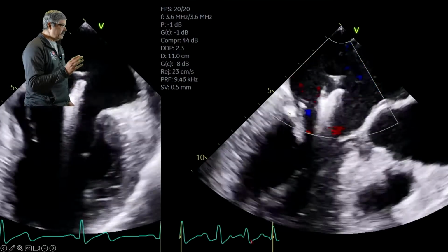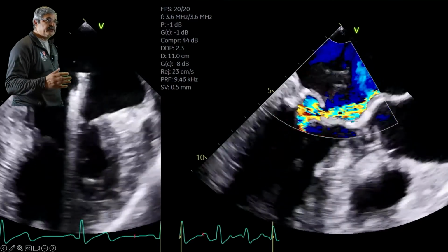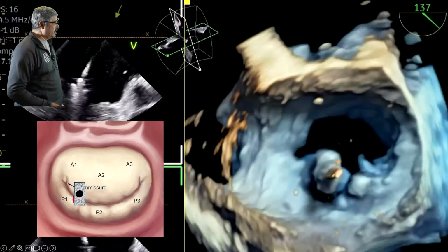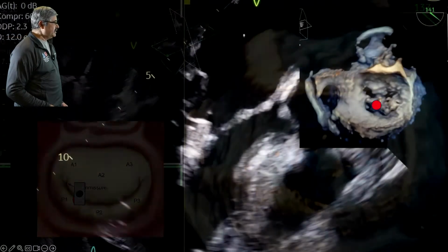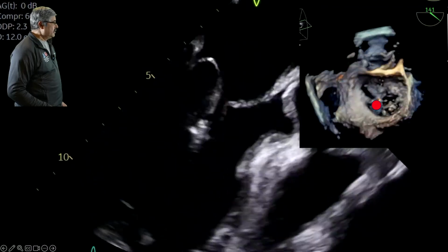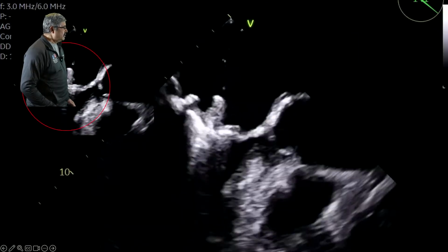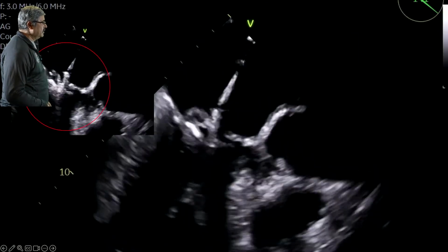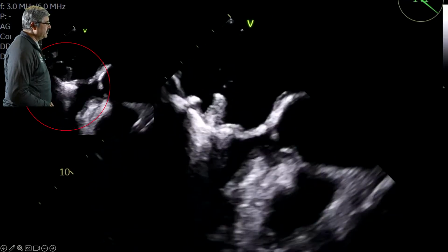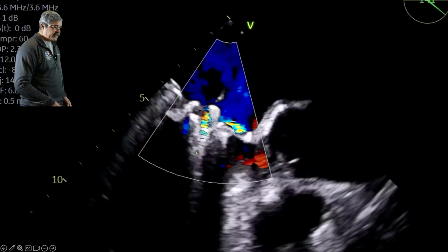Once we confirm that we are at A1P1, then we use simultaneous orthogonal plane imaging with 2D to confirm the position of the clip. And now we are exactly on top of the target where we need to be. We cross there. We are below the valve. Next, you see the leaflets, the graspers are opened. The leaflets are caught between the graspers and the arms, and then they will be closed after that. And as they are closed, there's less mitral regurgitation.